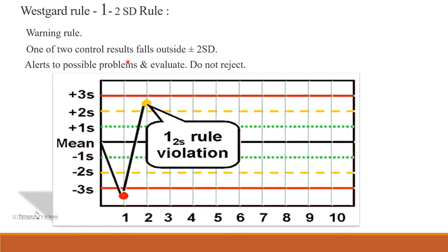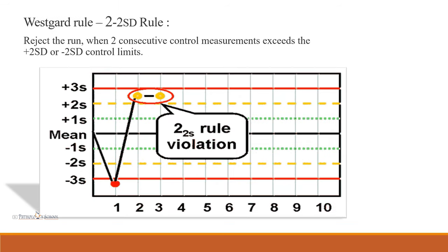The 1-2SD rule: one sample goes beyond plus 2 SD or minus 2 SD. You do not reject this run — it alerts to possible problems; we evaluate and correct the process. The 2-2SD rule: if two consecutive samples go outside 2 SD, then you must reject the run.